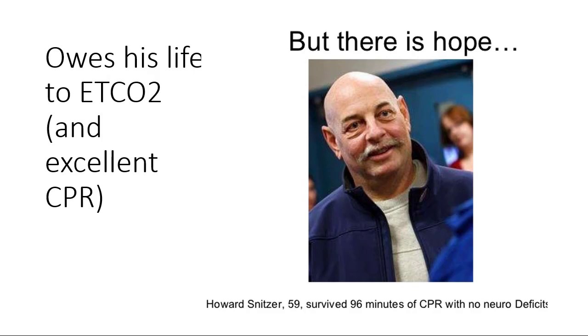The ALS crew shows up at approximately an hour of downtime. They walk up, and they see this conga line, so they're impressed. But they're like, this guy's been down an hour. Does he really have a chance of survival? They intubate him, they start a line, they put end-tidal CO2 on him. This is the first ALS they've had, an hour with just BLS. They would have normally called it after an hour, but his end-tidal CO2 is in the 35 to 45 range, so they keep working it.